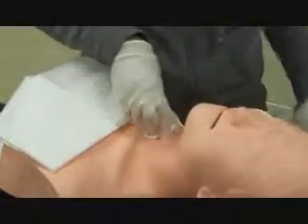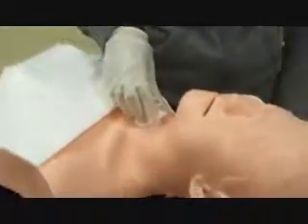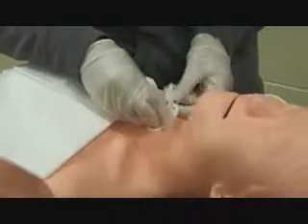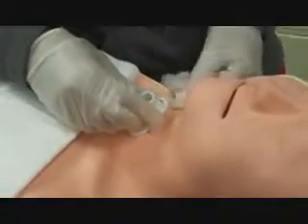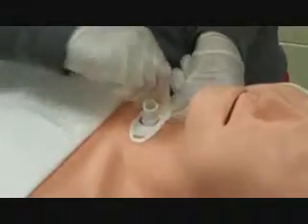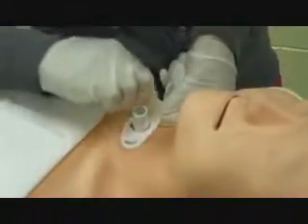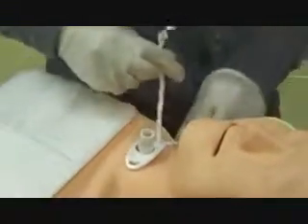When doing this, you want to make sure that you have at least 2 fingers' length to put under the patient's neck, just as when securing an endotracheal tube. You put the tie under it.